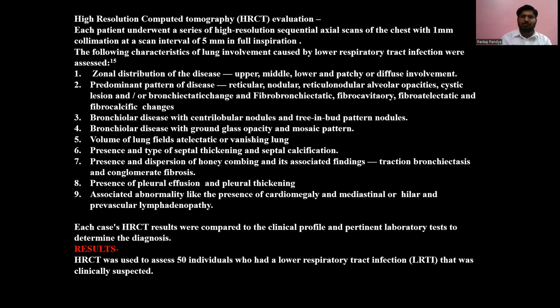The following characteristics of lung involvement caused by lower respiratory tract infection were assessed: zonal distribution of disease, likely upper, mid, and lower, and patchy involvement; predominant pattern of disease, likely reticular, nodular, alveolar opacity, cystic lesion, ectatic, fibrotic, fibrocavitary, and fibrocalcific changes. Bronchiolar disease with centrilobular nodules, a tree in bud pattern, nodules. Bronchiolar disease with GGOs and mosaic pattern.